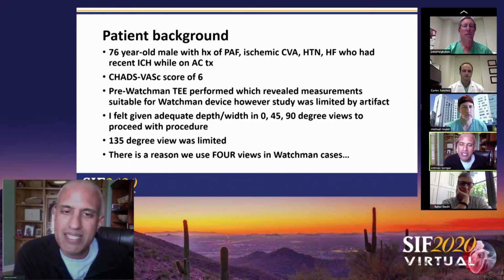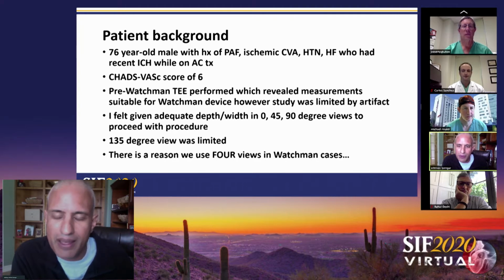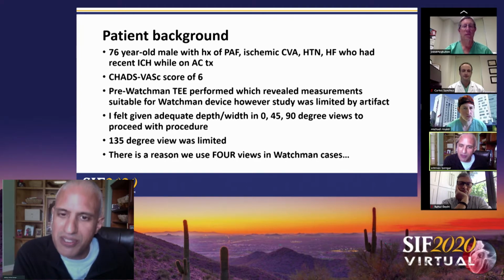This pre-TEE was not done with anesthesia. It was done with, I think, conscious sedation, and there was some movement of the patient. So the echocardiographer had some difficulty getting the 135 view. I think this is an important point first and foremost: don't cut corners when you're assessing patients prior to the procedure. The 135 degree view was limited, and there is a reason we use 4 views in Watchman cases.